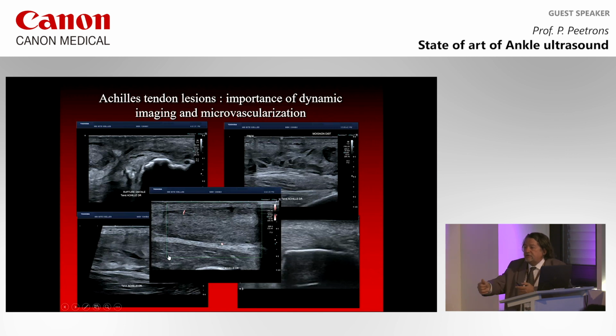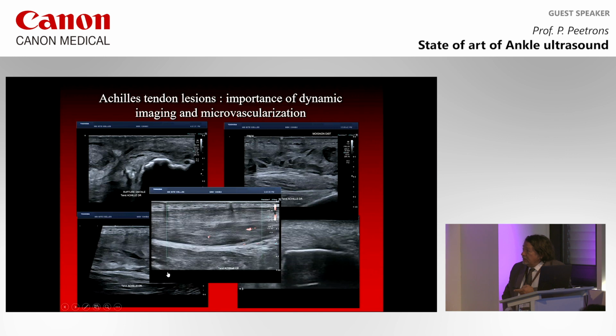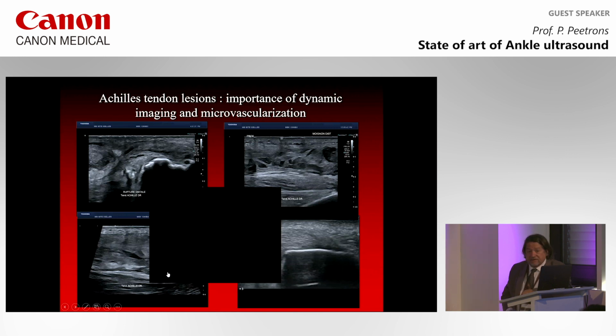If you just push the microvascular Doppler button and you don't remember that the foot is in dorsal flexion, you will see this. Nothing inside the tendon. No, nothing. And then suddenly you remember and you ask the patient to move to plantar flexion or to relax, and you see the microvascular imaging in the tendon.